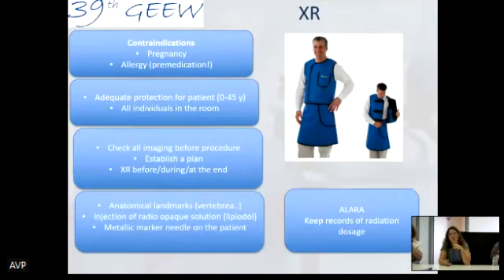We offer protection, I talked about pregnancy, but for everybody who can still procreate and give birth, and also for all individuals in the room. So everybody has protective clothing. And the control, oh yeah, and the measurement of the X-ray.